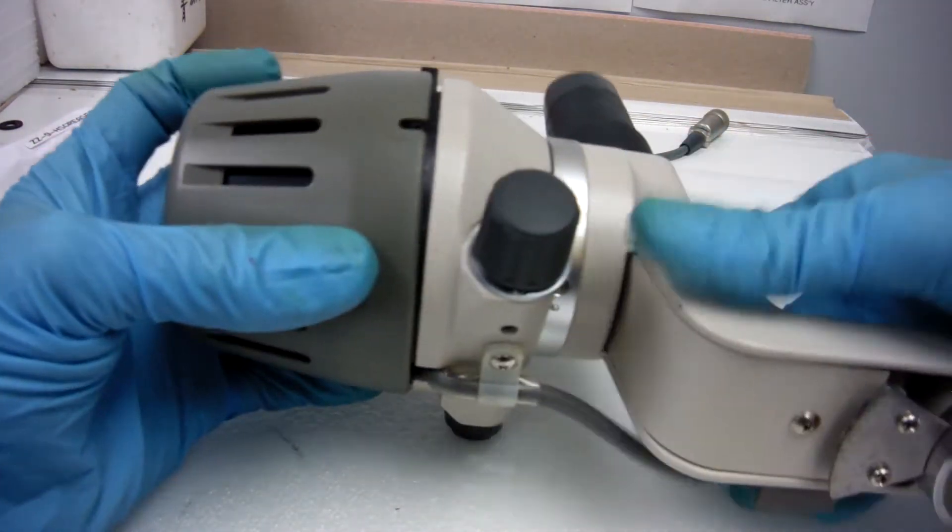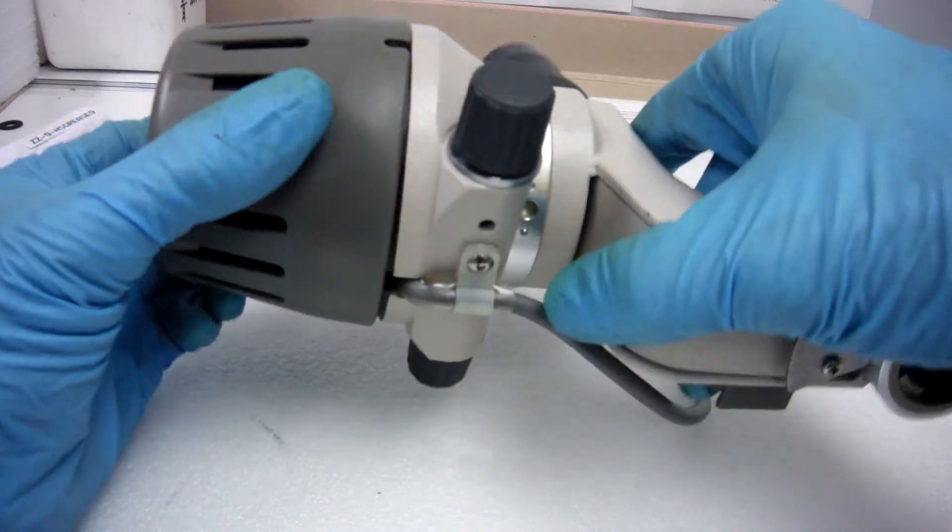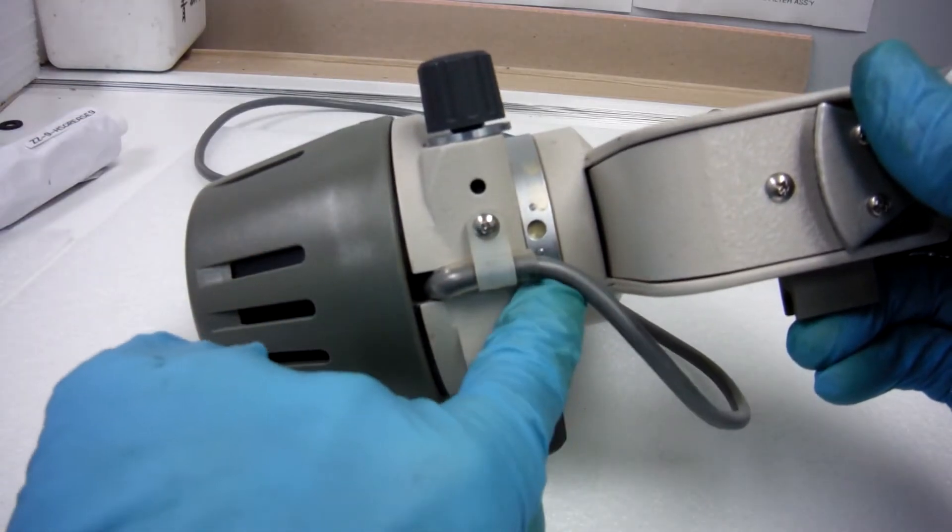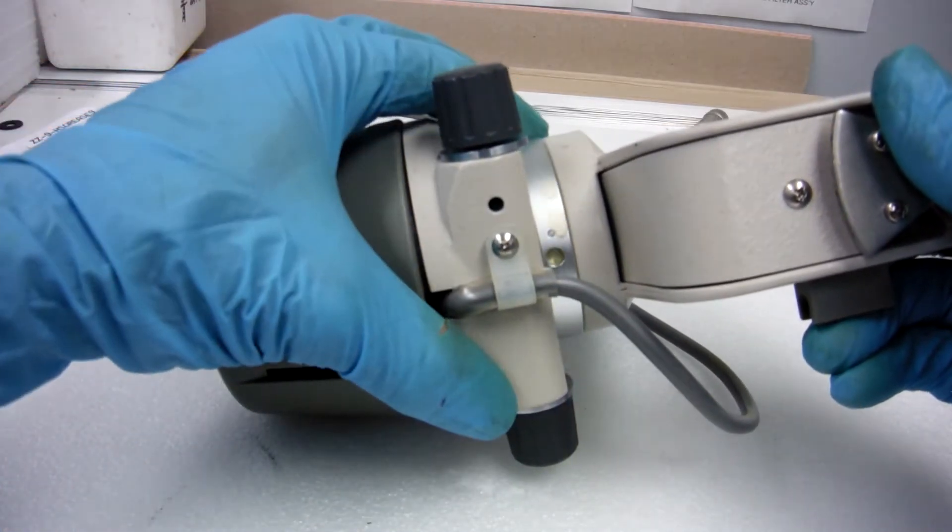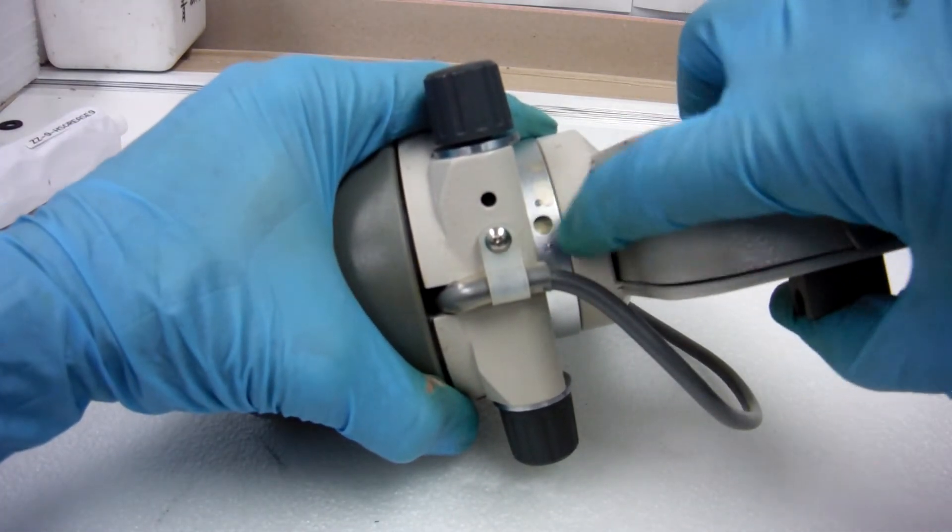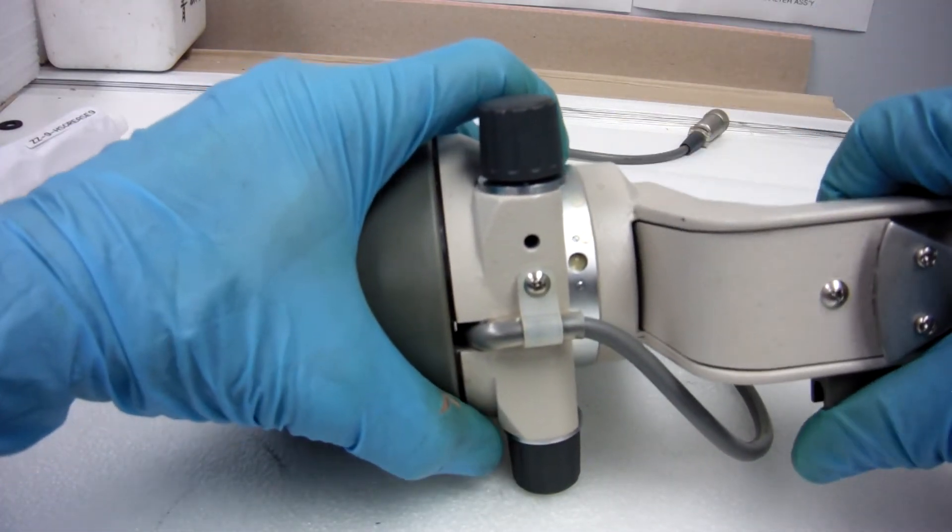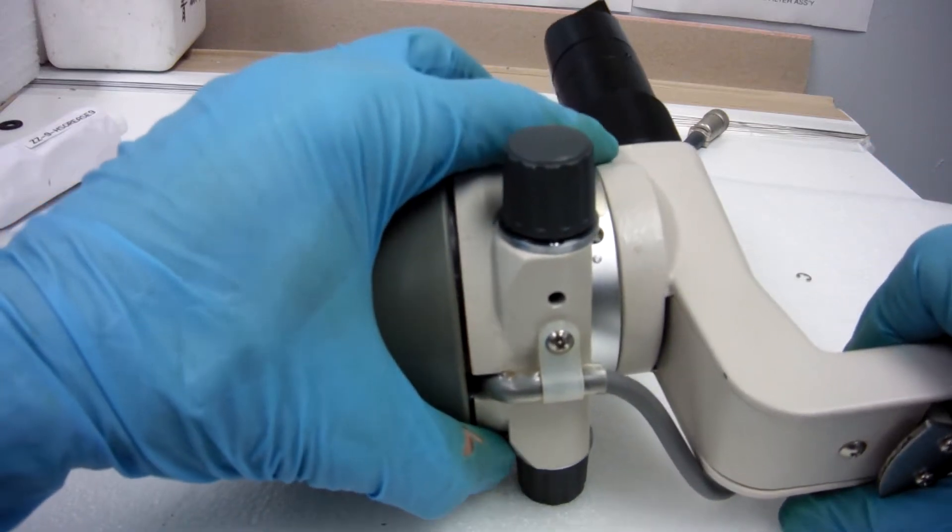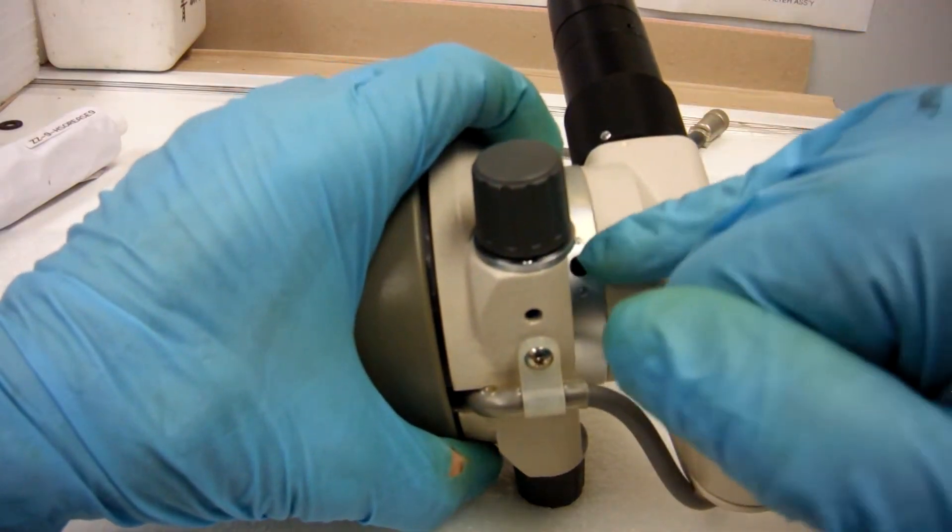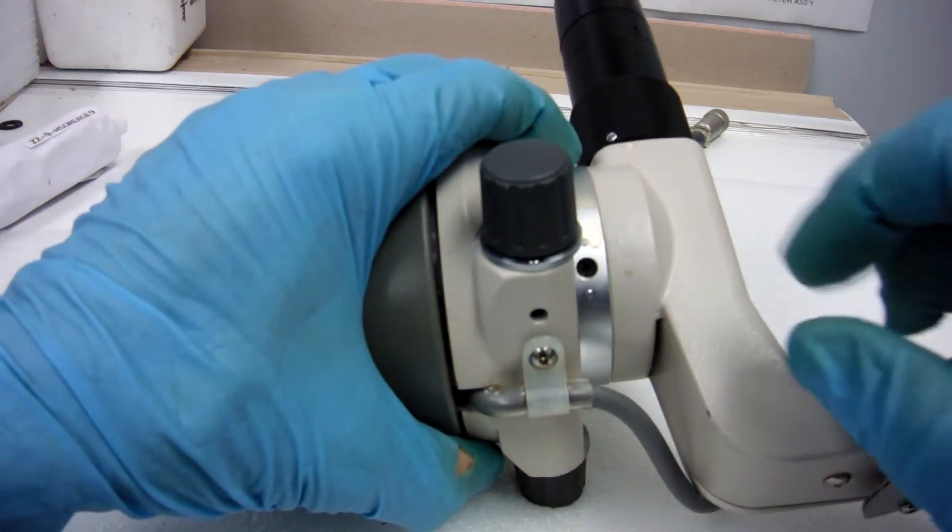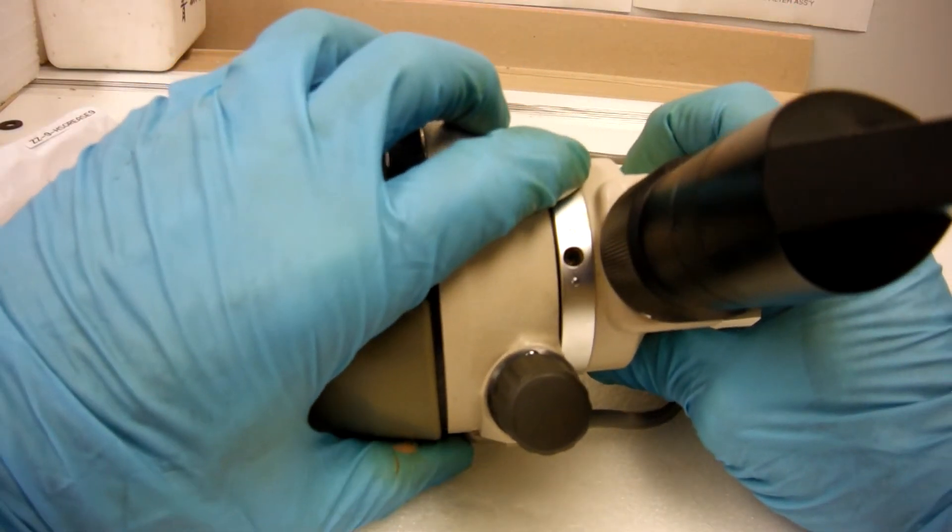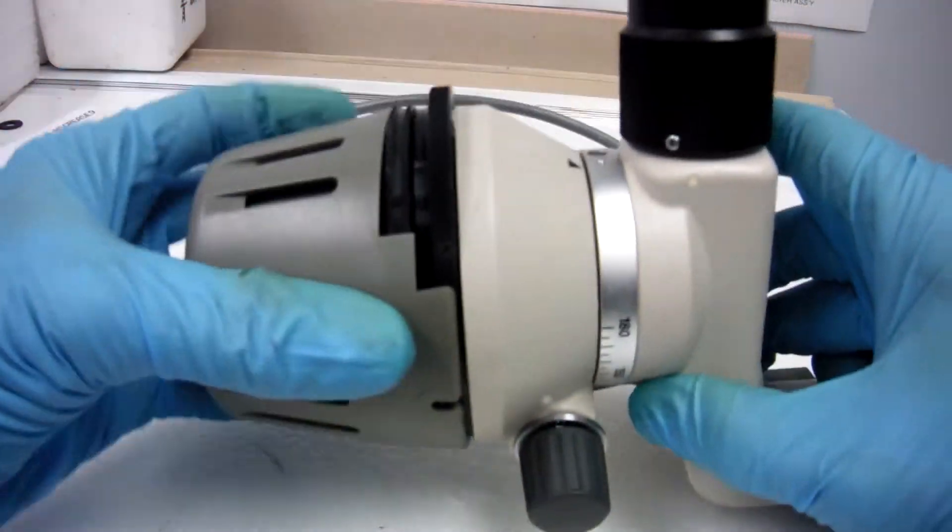We're just going to tighten the body up. Underneath here there are two set screws that hold this graduated ring. You would loosen those and then this graduated ring could turn and you could tighten. There's three Phillips, one on each side and one in the middle, that you would tighten. And that would tighten your body up.